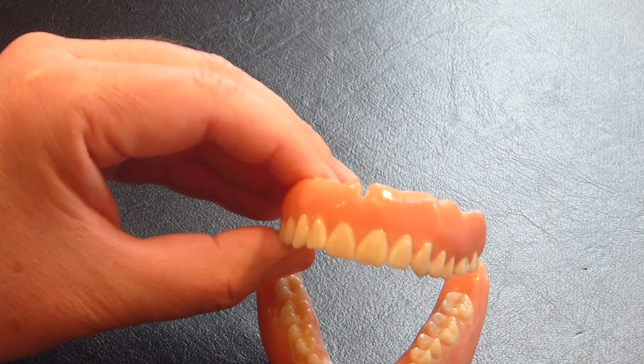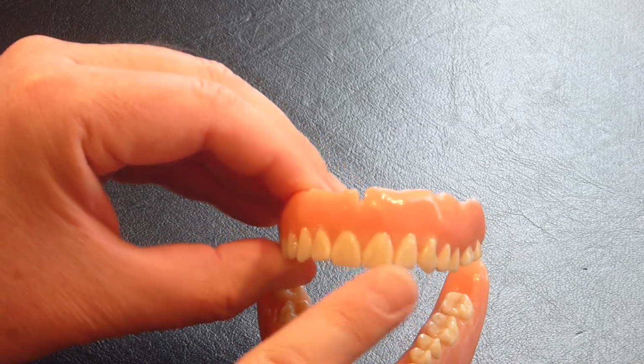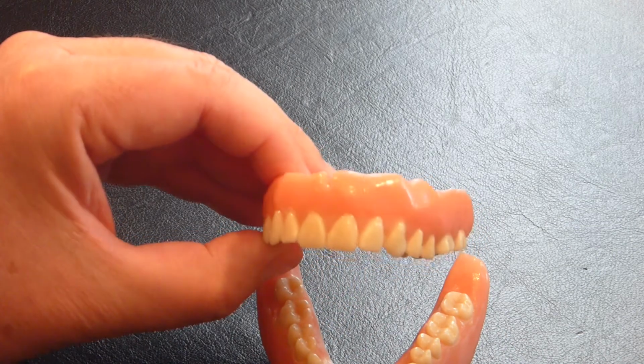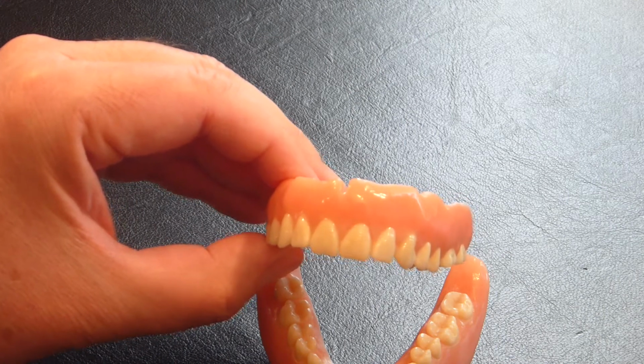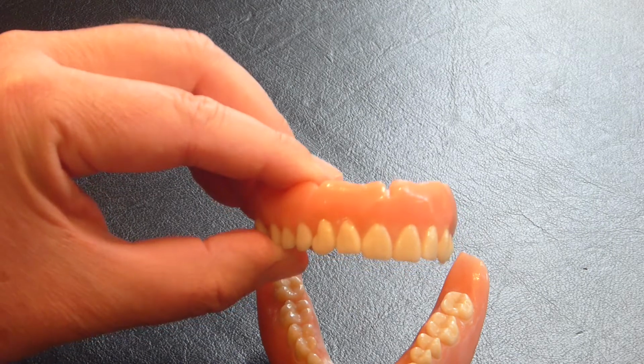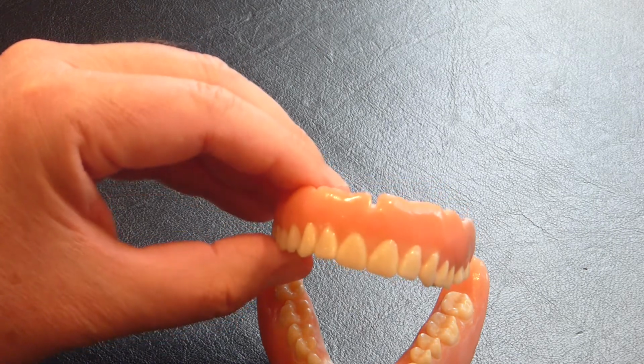That's more youthful looking, and then a more mature look would be to have the edges of the teeth all even. That's a look because as people use their teeth throughout their life, the ends tend to wear, and then eventually they all kind of end up being the same length for some people.